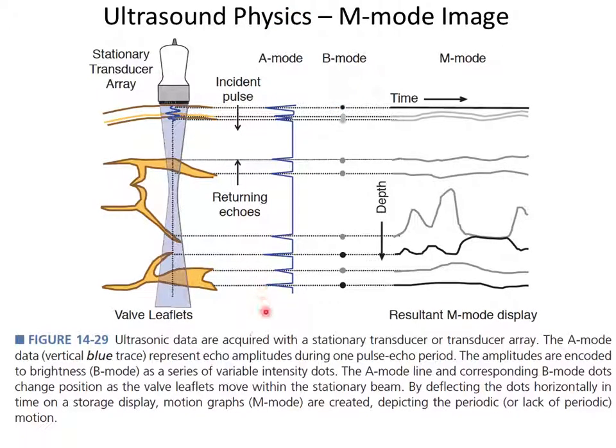A B-mode image plot of this data is just like we set a threshold for an echo amplitude to say, if my echo amplitude reaches a certain threshold, I'm going to call that a surface, and I'll put a point in my image. And the brightness of that point I can make proportional to the height of this echo, or I can just put a digital point, say, there's an edge there. Usually you make it proportional to the brightness, and that's called a B mode.